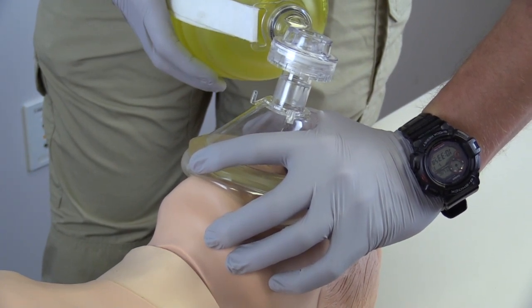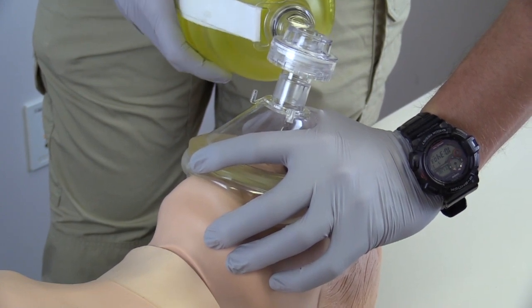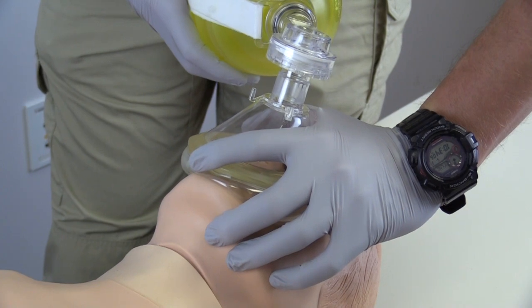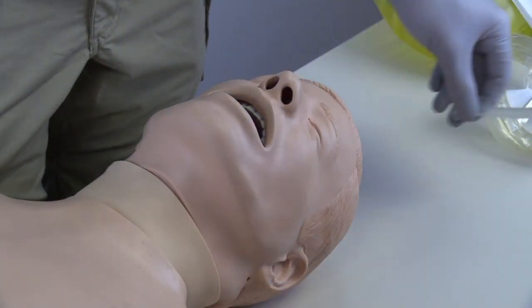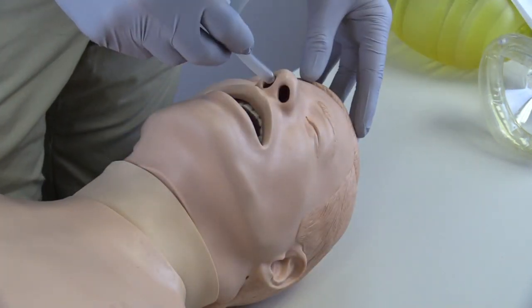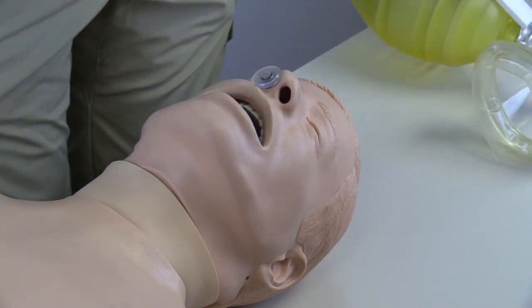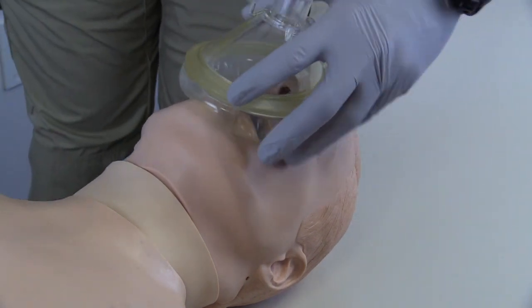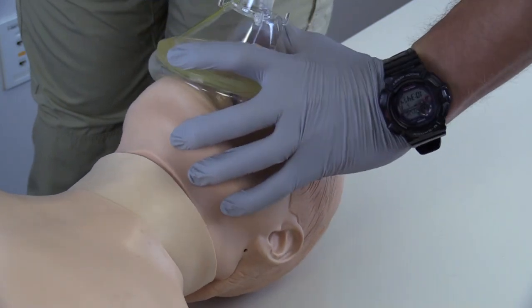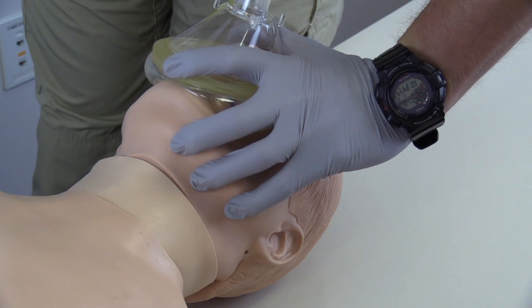If the patient begins to gag on the oropharyngeal airway, I must remove it. I could consider inserting a nasopharyngeal airway, which is measured from the tip of the nose to the earlobe. The distal tip of the nasopharyngeal airway will need to be lubricated with a water-soluble lubricant prior to insertion. I will insert the nasopharyngeal airway with the bevel towards the septum and rotate it as needed. I will be careful not to force the nasopharyngeal airway, and if I meet resistance, I will remove the device and try the other nare.